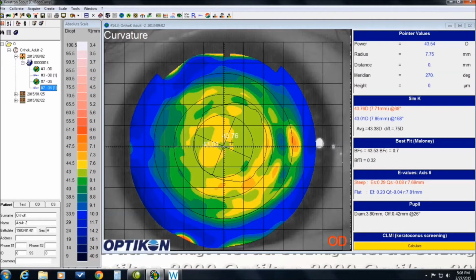Now I did notice in this picture, and it shows up better with the slit lamp, she has a pinguecula starting up over here on the right eye, which is another point about inspecting my topography. Now this is a good map, but you'll notice it's kind of splotchy. There's spots, little flat areas here and there, little steep areas here and there, flat, steep, flat, steep. And what these indicate is that this is a dry eye, and the pinguecula is also an indication.